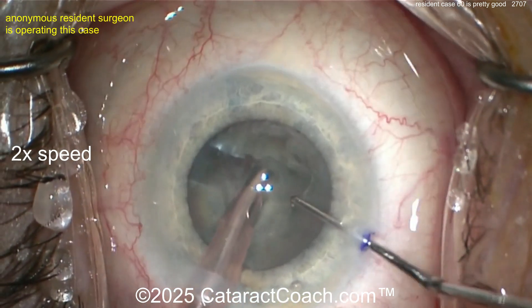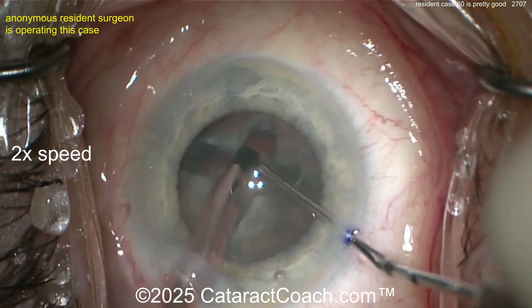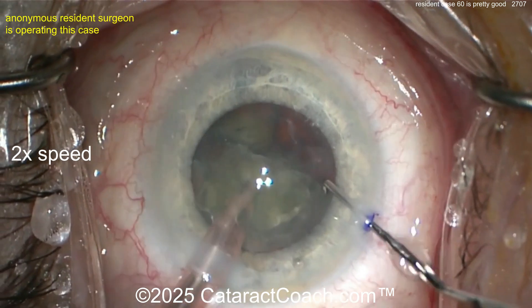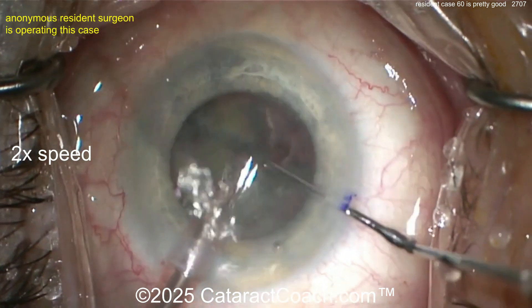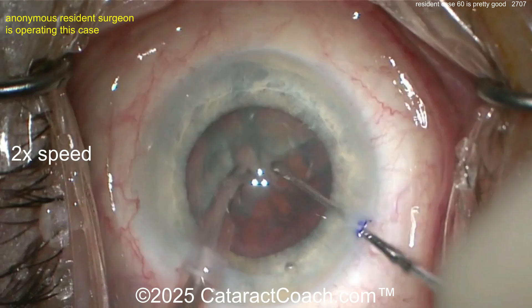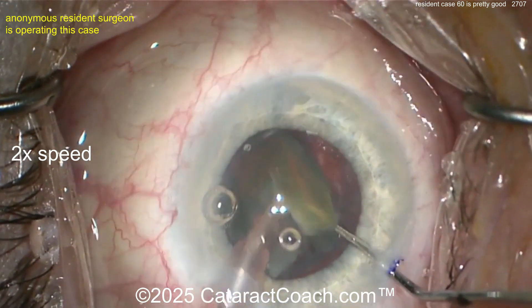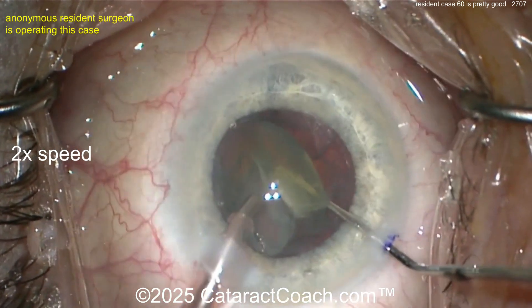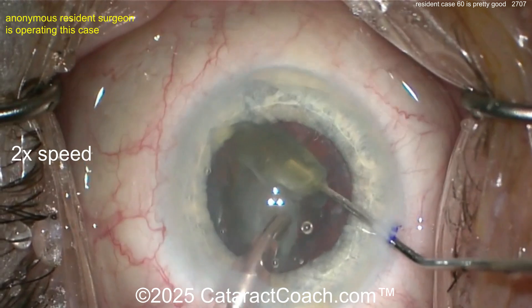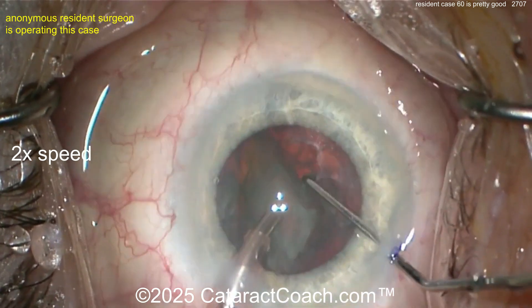A little bit more groove, a little bit more, and let's see — split this. There you go. Now go to the higher vacuum mode, bring the pieces up, and they should come out pretty easily. Nicely done — I like how the eye is staying in primary. A pretty darn good job for case 60. Good rotation of the nucleus — fully separate those two halves. They're still attached. That's what I was telling you: when you have that separation you've got to propagate all the way through. These two quarters are still attached — this is one big hemi-nuclear piece. The chop didn't fully propagate.